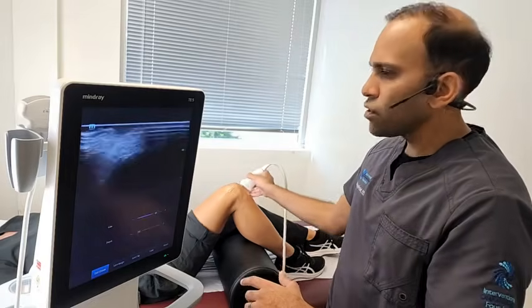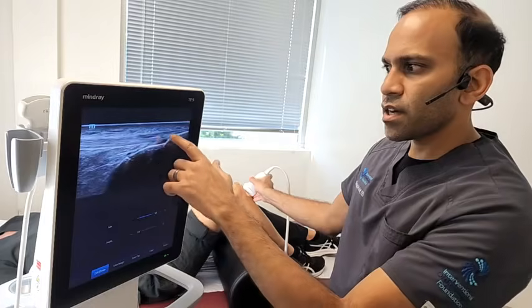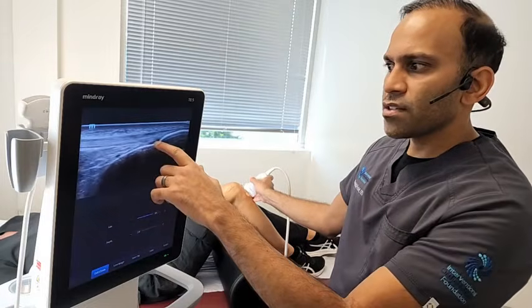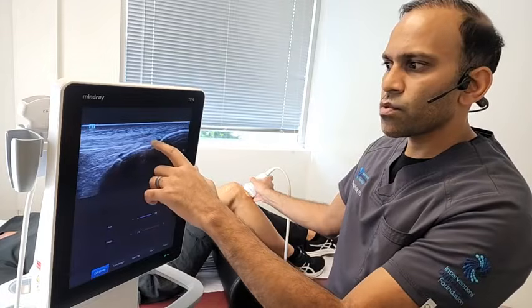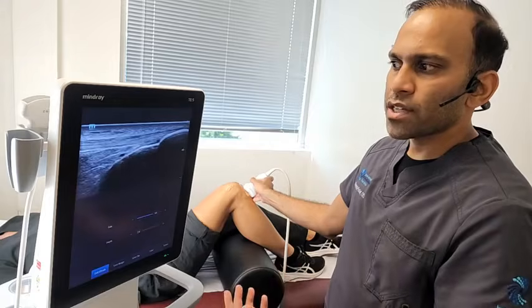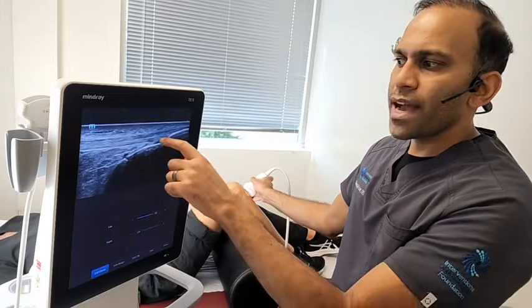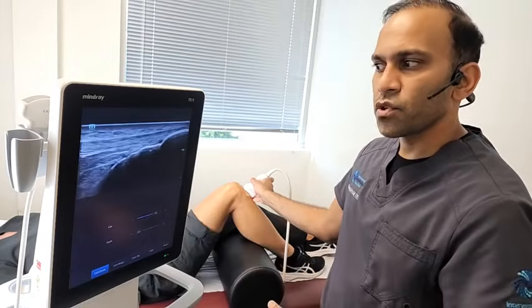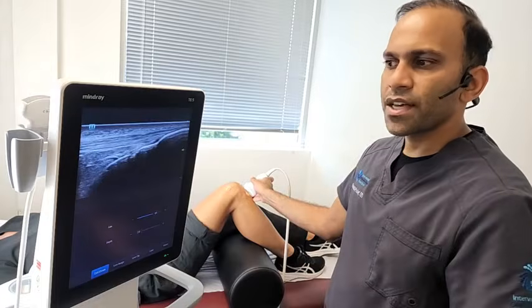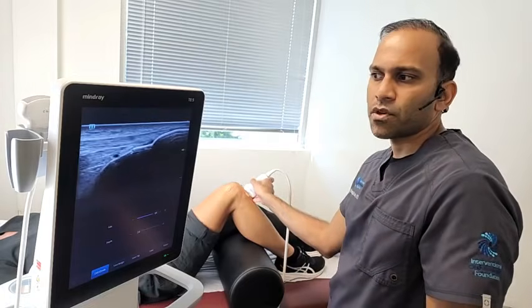Now, I'll look down in this area over here, which is where the patellar tendon attaches onto the lower leg bone. And in this area, you can see there's a little bit of black right here, but if this was a lot more black in this area, black in ultrasound, other than the black that we see past bone, black in other areas actually refers to fluid. So if we saw some black in this area, which we don't, we could say that there's some bursitis or inflammation going on where the tendon attaches onto the bone.